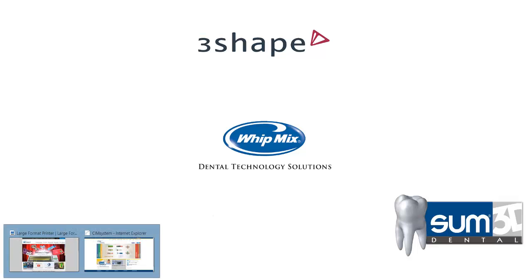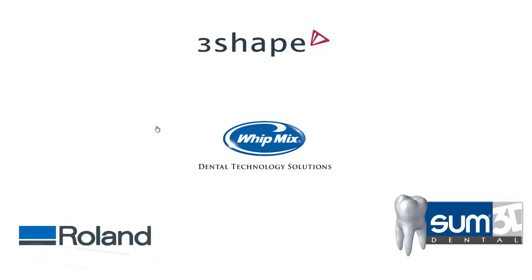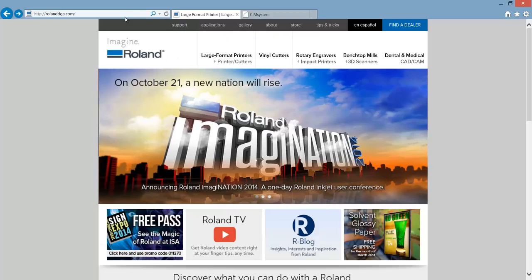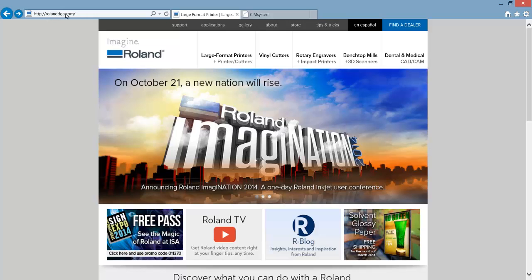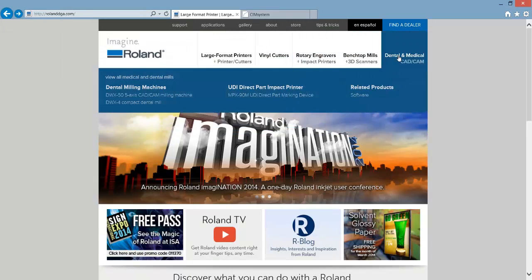So open a browser, navigate to RolandDGA.com, and then when the page loads click Dental and Medical CAD CAM.